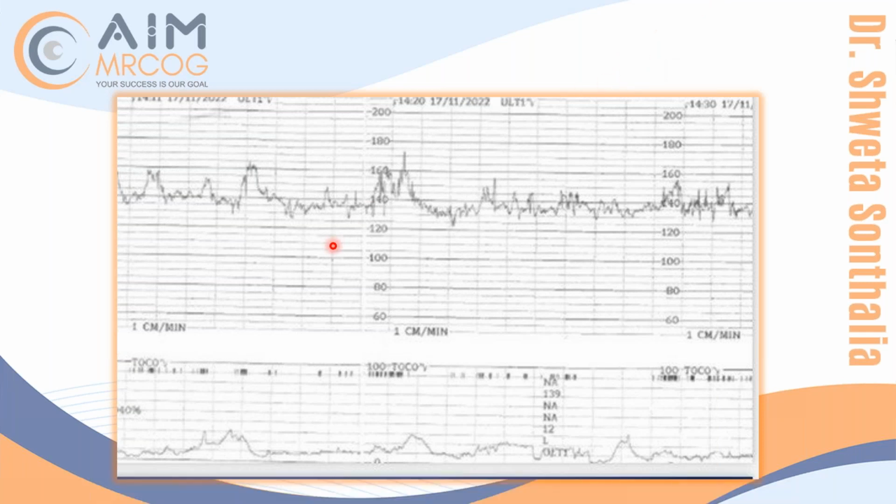Yeah, anyone can open the mic and just tell me. This is not a question scenario. I'm just checking how much you understood about a CTG. What is the baseline, variability, acceleration, deceleration?